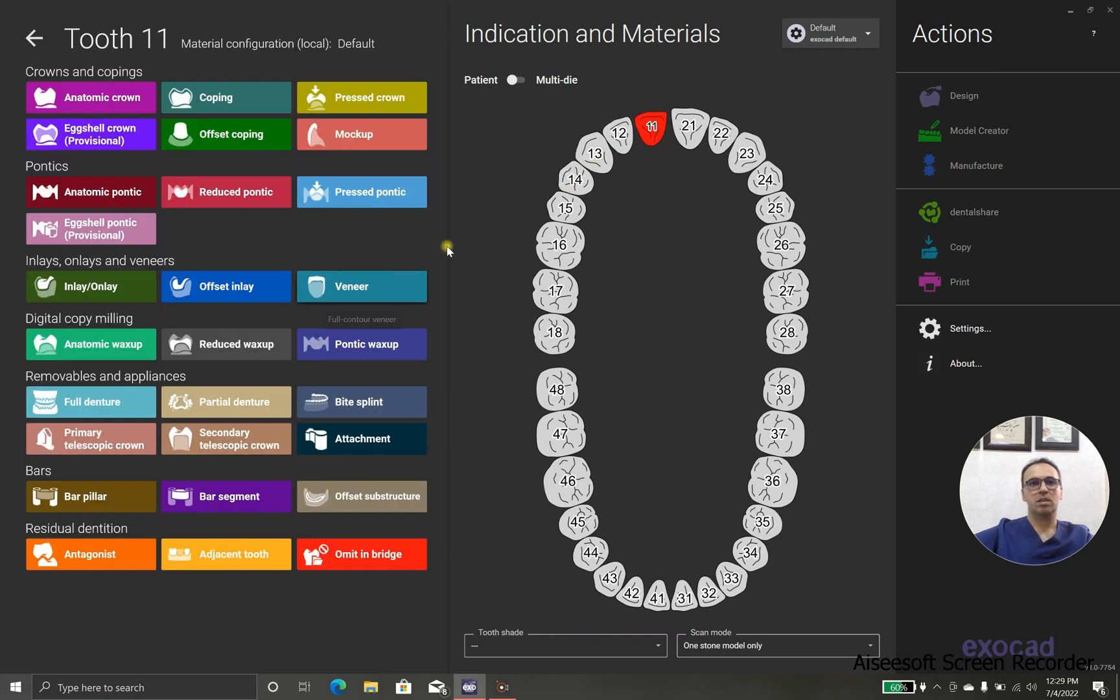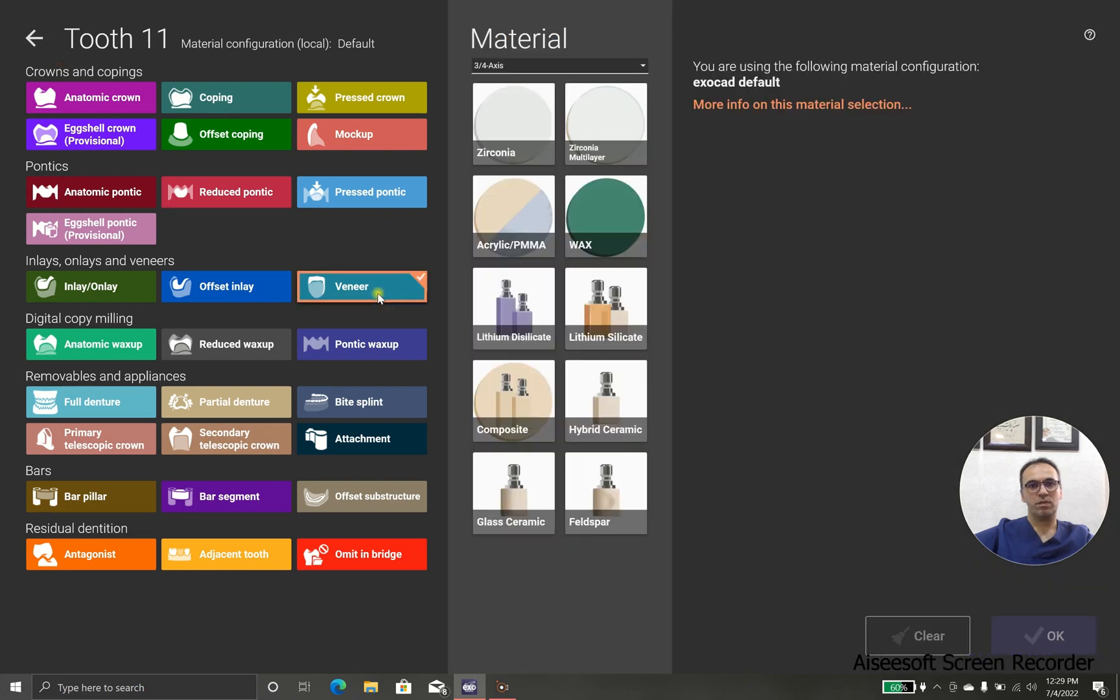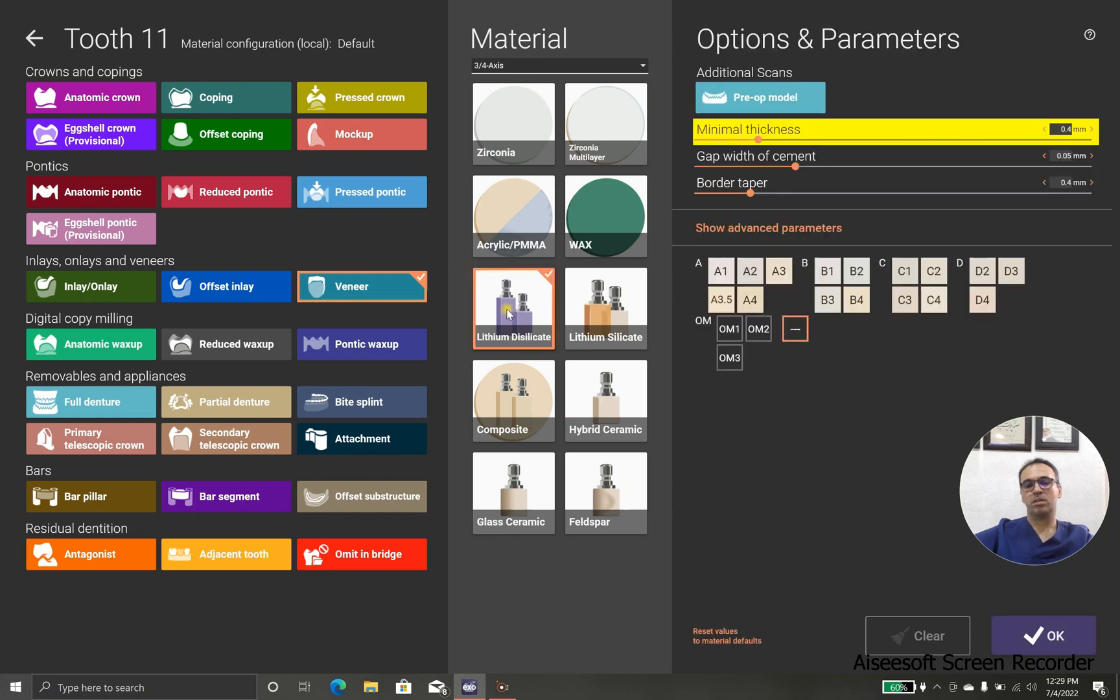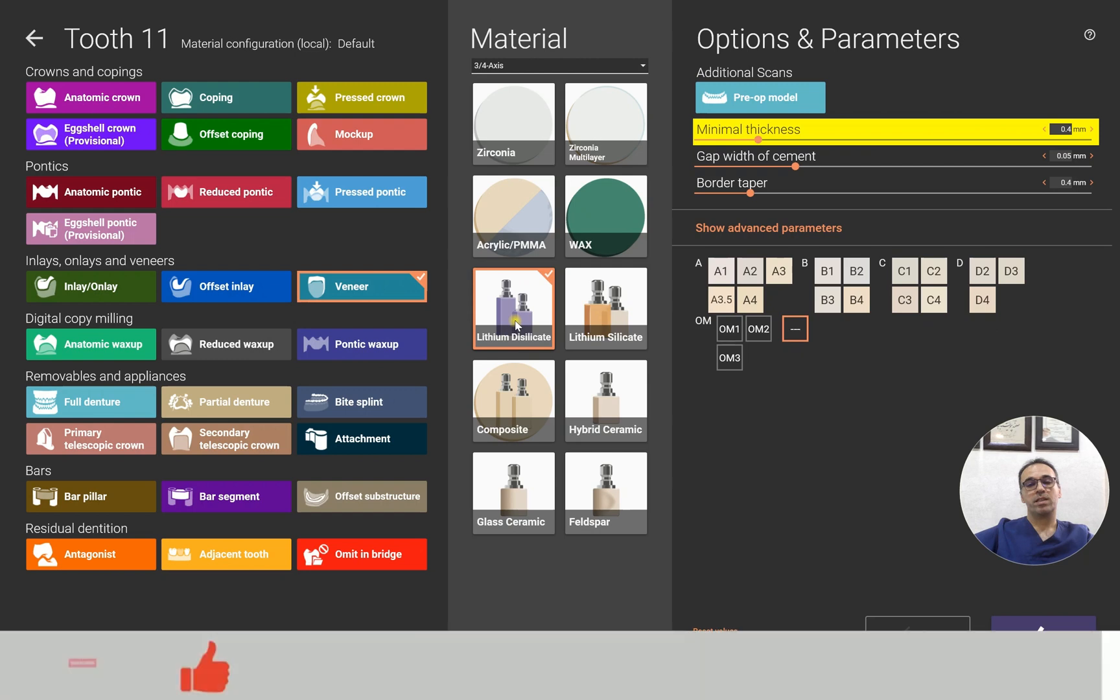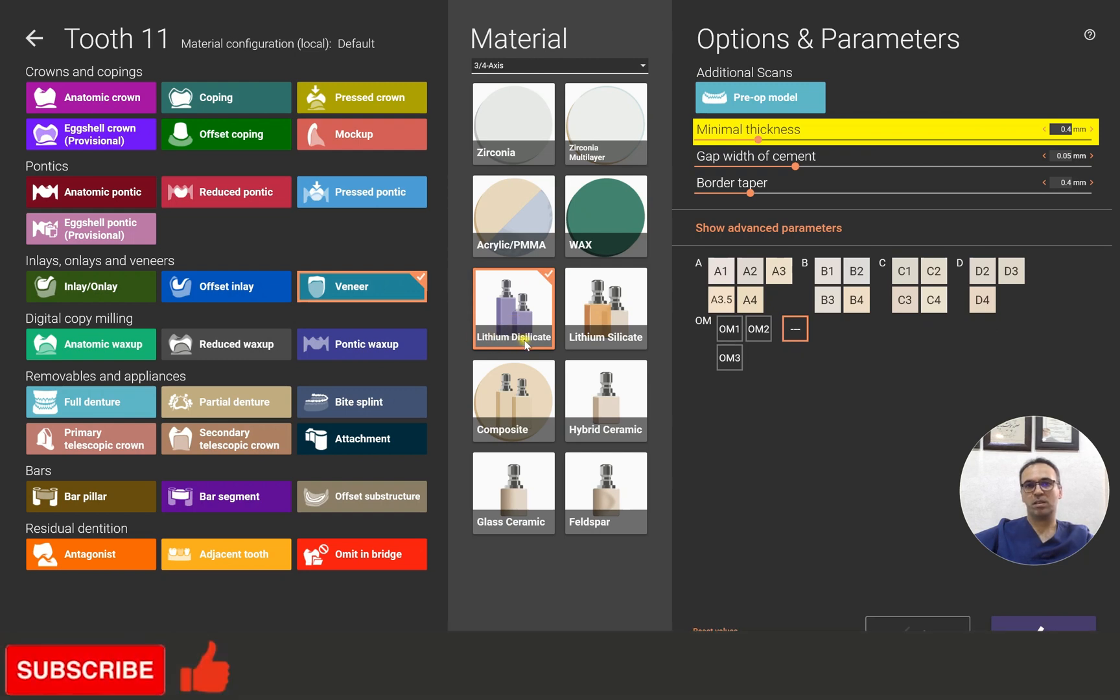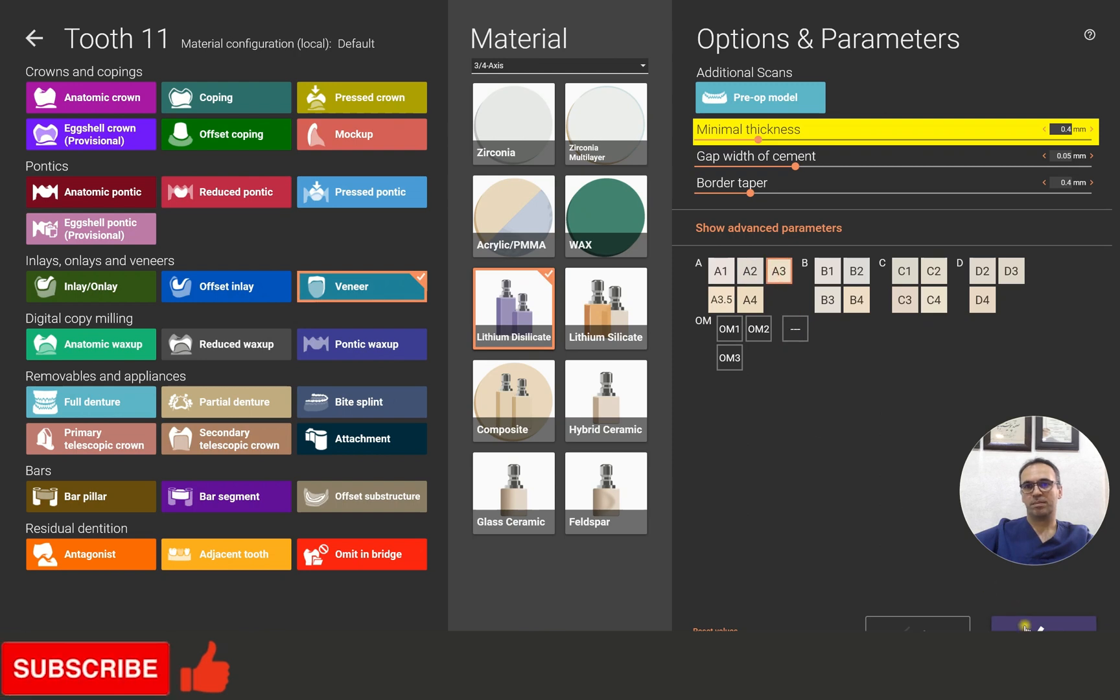We are going to indications. I choose veneer because I'm going to mill it with InLab M6L by Sirona, that's a 4-axis milling machine. I use 4-axis, and I want to use IPS Empress Emacs CAD, so I choose lithium disilicate with shade A3.